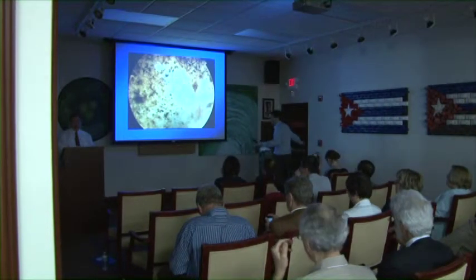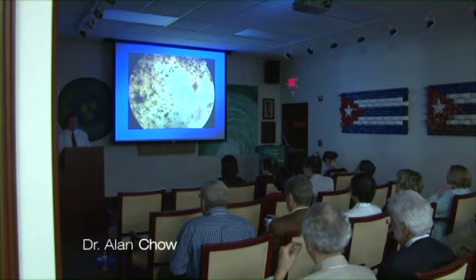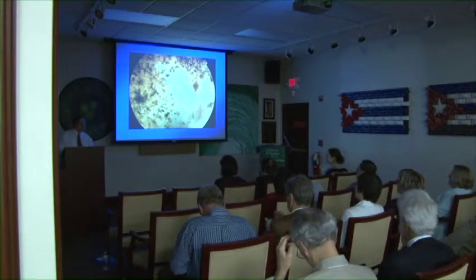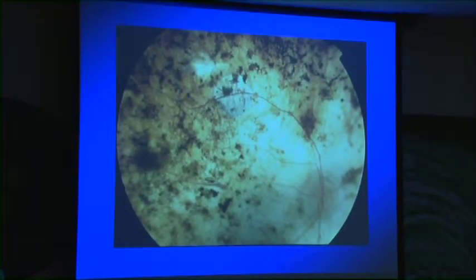Historically, retinitis pigmentosa has been known as a condition with no treatment, but beginning in the 1980s and 90s, new therapies were proposed, including retinal cell transplantation and also retinal prosthesis development. We were the developer of the artificial silicon retina, the first retinal prosthesis. We've been involved in a number of clinical studies. I'm here to report some of the long-term effects and the results in some of these patients.